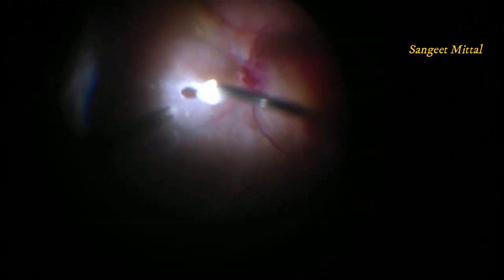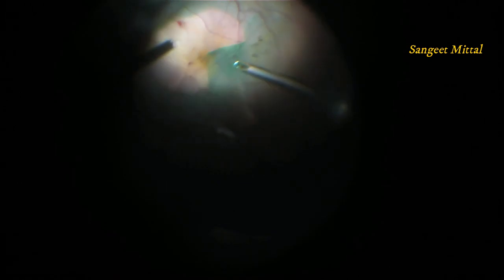This is a case of combined retinal detachment. Preretinal membranes were removed. Preretinal blood was cleared from the macula. Even ILM peeling was done. While doing vitreous shaving, a thin peripheral blood lining was seen. Triamcinolone was injected to stain the vitreous. The layer of vitreous was then peeled off from this peripheral blood line.